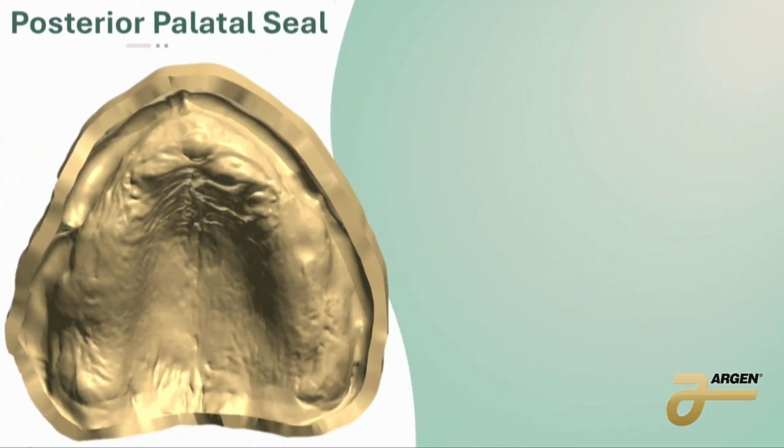So what about a posterior palatal seal? This is honestly, when we get into digital dentures, one of the biggest questions that I have. Well, now it's digital. Why are we doing post-dams? Because the original thinking and the original way a lot of us were trained to think is the reason why we're doing a post-dam is because we are now adjusting for that shrinkage in material, right? I know there are some lab techs who say, no, I'm really good at packing. Doesn't matter how good you are at packing, doesn't matter if you're using IvoCap, IvoBase, whatever you're using, you're still going to have some shrinkage because we are changing a liquid and a powder into a solid.